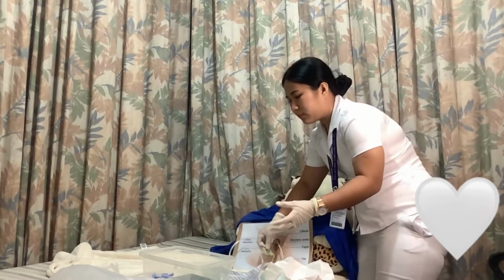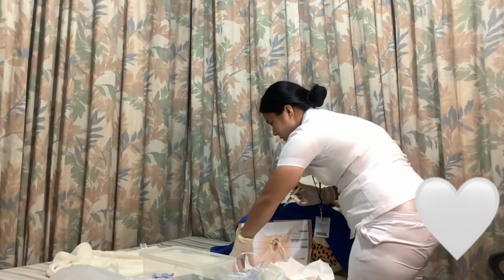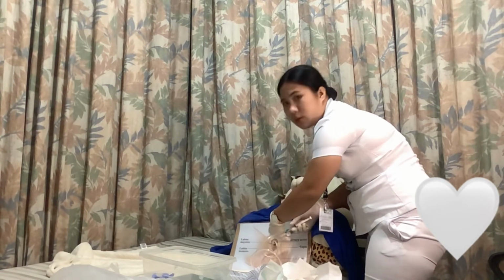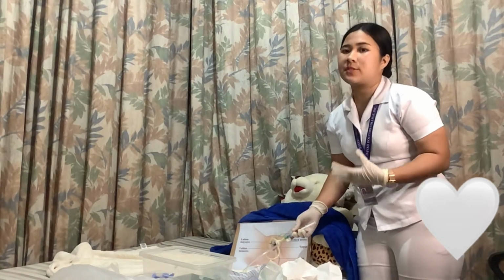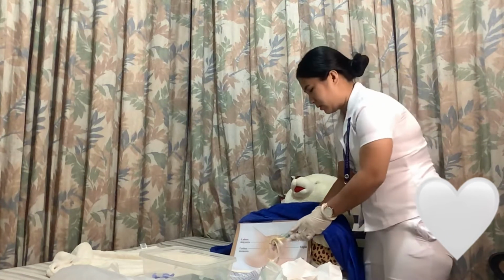And I'm gonna insert this. So inflate the balloon with 10 to 15 cc of sterile water using a 15 to 20 cc syringe to make sure there is no leakage of the water from the balloon.